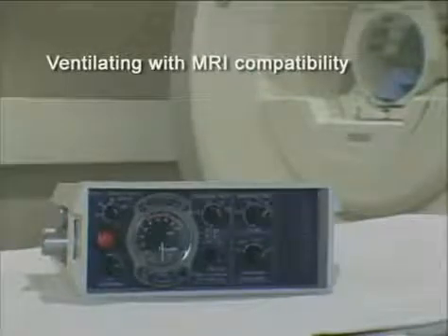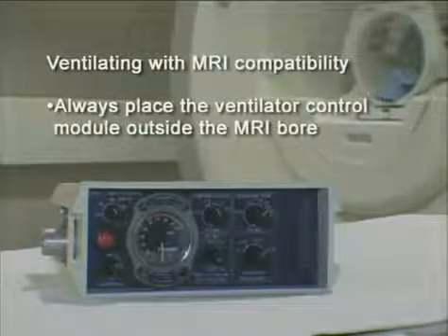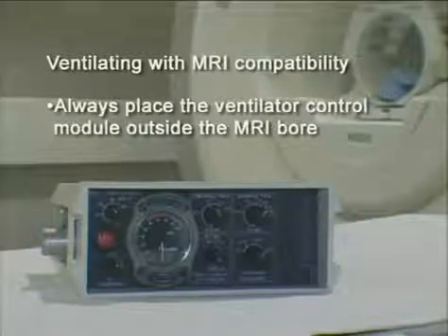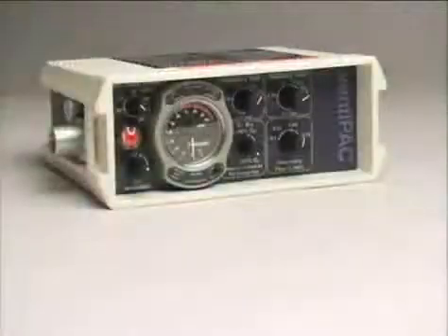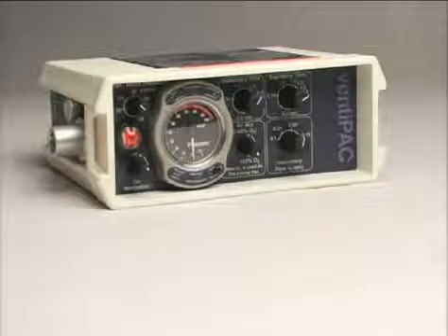Nevertheless, you should adhere to responsible ventilation practices by always placing the ventilator control module outside the bore. This allows you to properly observe the ventilator and adjust the controls as necessary. For further information on the ventiPAC ventilator, consult your user's manual or contact your Smiths Medical representative.